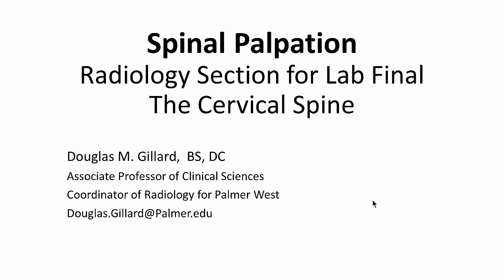Hi guys, it's Dr. Gillard. This is a presentation over cervical spine radiographic findings, which there'll be a few questions on your final spinal palpation lab test. So study this stuff well, and here we go.